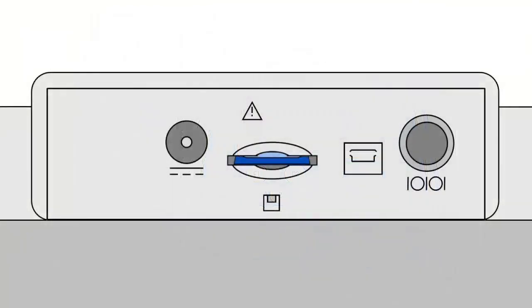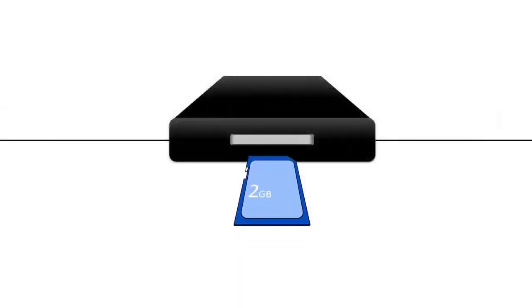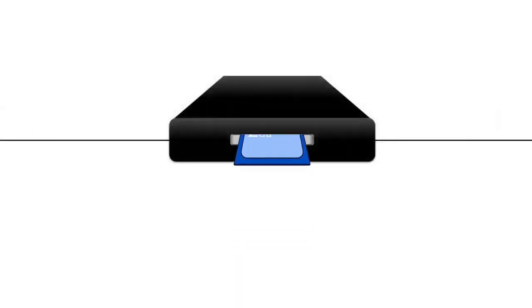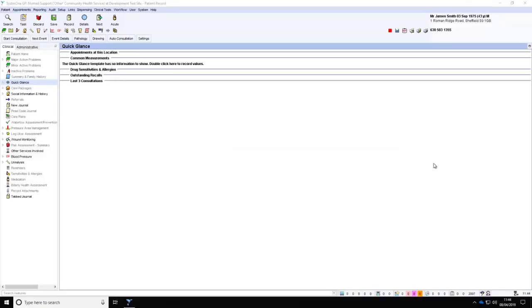To send the ECG file to the patient record system, eject the memory card located on the back of the machine by pressing in the card and allowing it to pop out. The memory card can now be placed into the card reader connected to the PC running the patient record system. Once connected, ensure that you have the correct patient open within System 1.